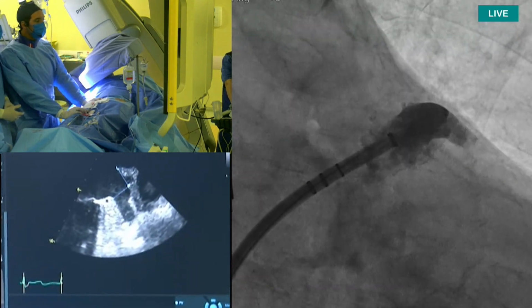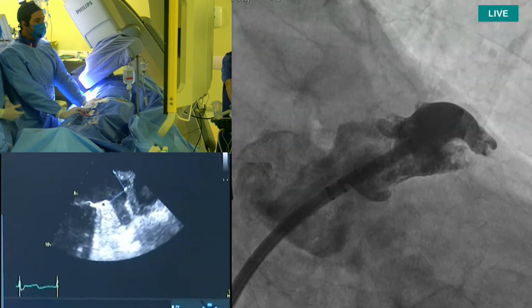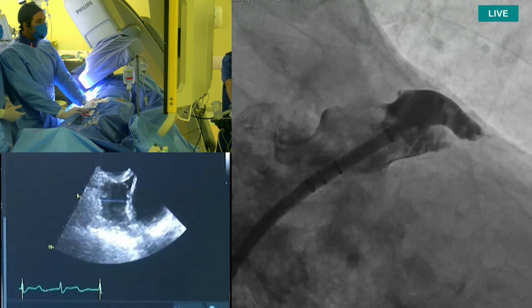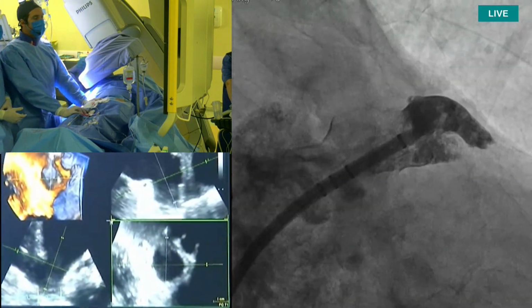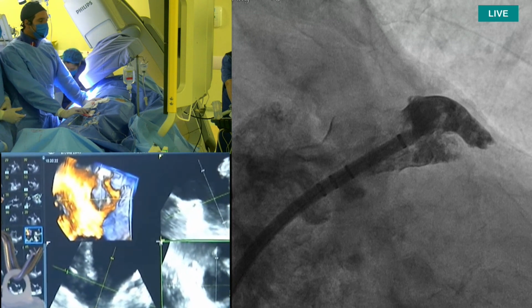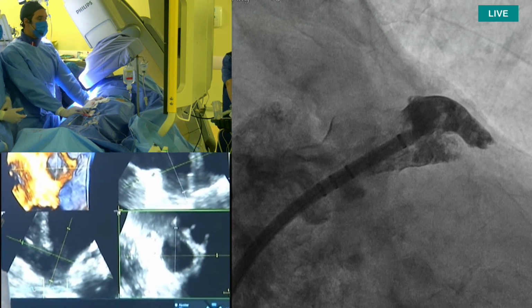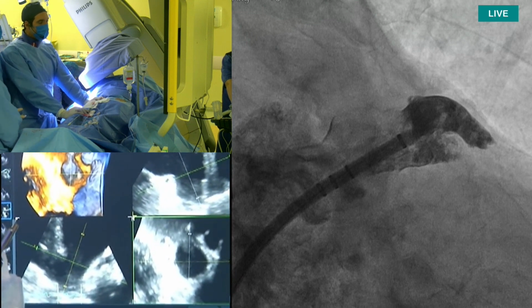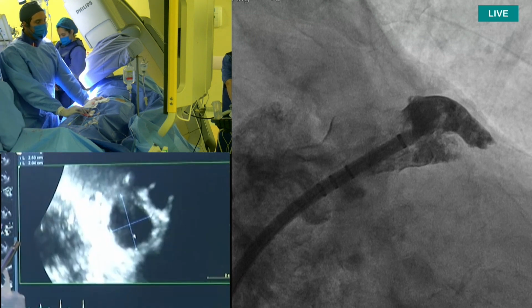Okay, she's going to keep on rolling. Now the 90 degree angulation, 18, and then 135, which I think is always the hardest one for the echo guys, and it's around 25. So I would say it's a little bit under what we measured through the CT, what is expected. We have a good atrial pressure here, so we had to be careful to bring this patient to the hospital before, to get good hydration, because it can be kind of a bias when the patient has a low volume inside the atrium.